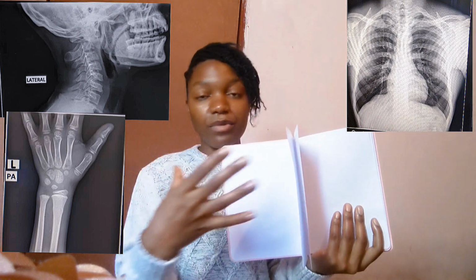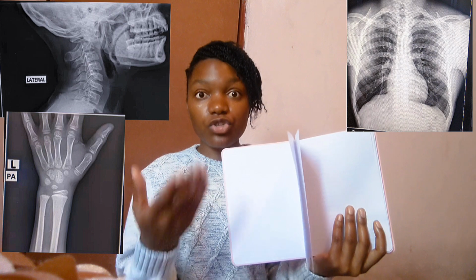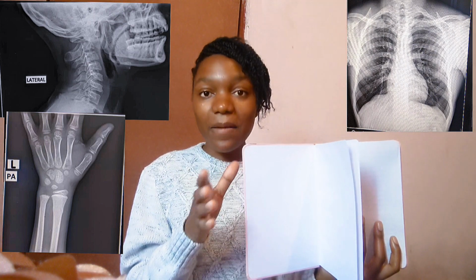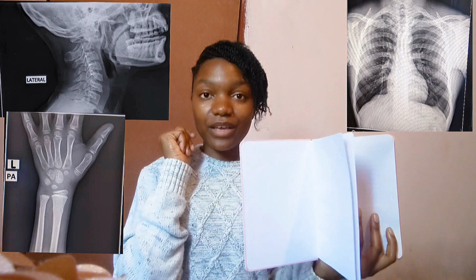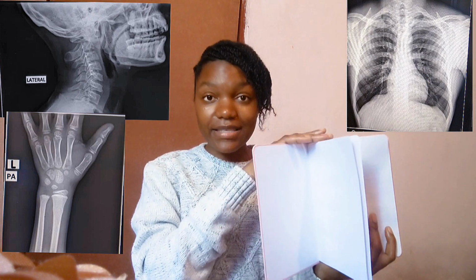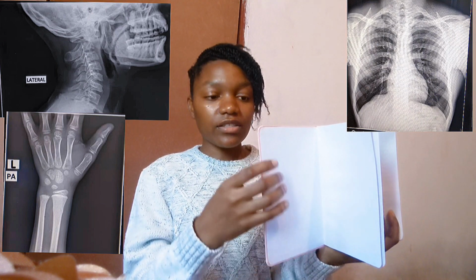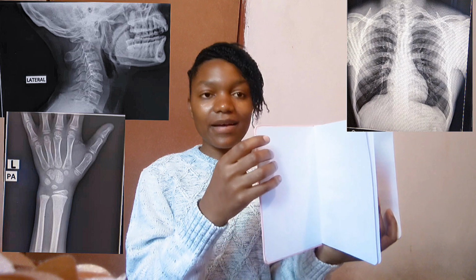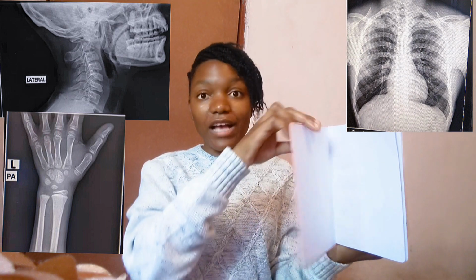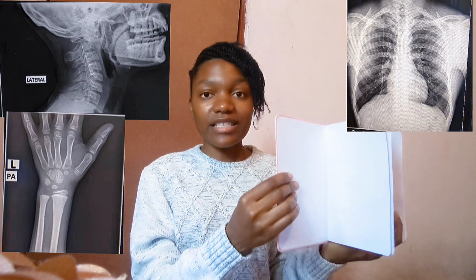So you can imagine this in the body of the patient or your body, right? So if the x-rays, the energy from the x-ray tube, come, they have to interact with this. When it reaches this part, since it's denser, the energy will not really pass through it, because it's very hard and really dense.